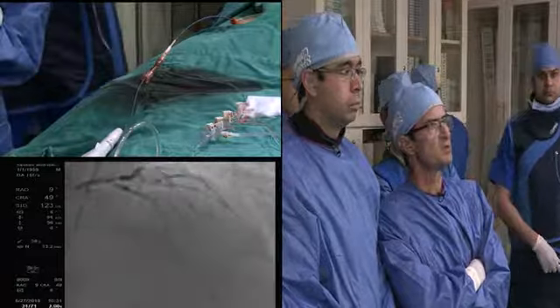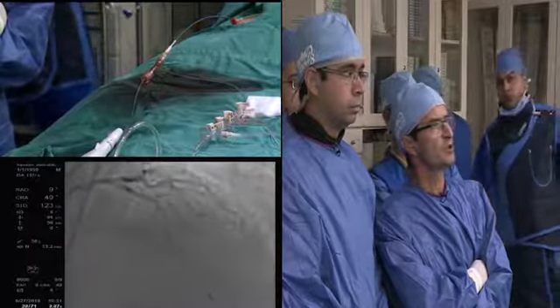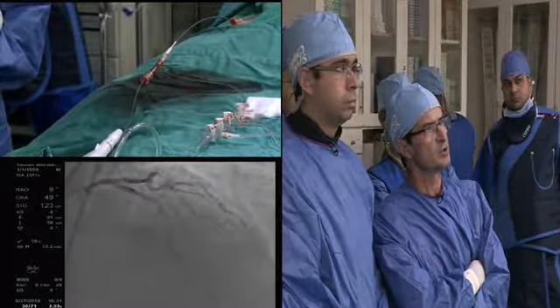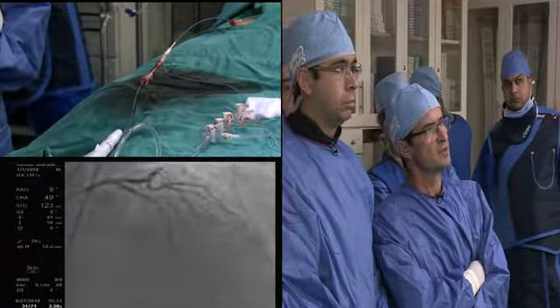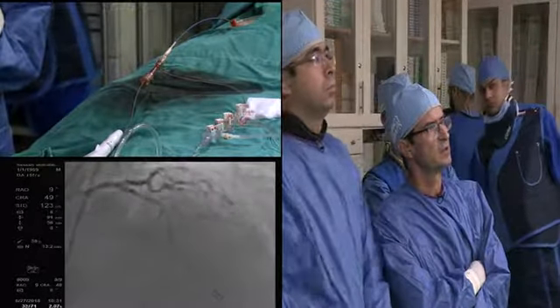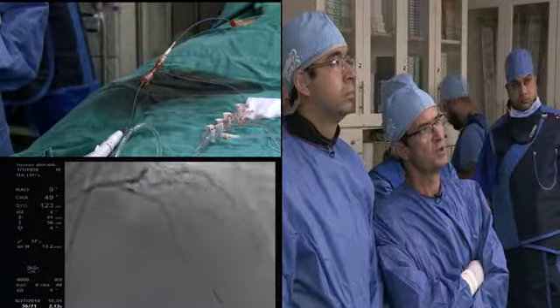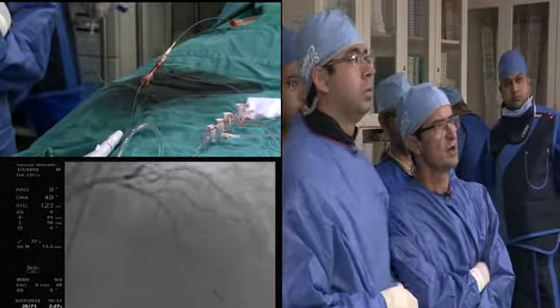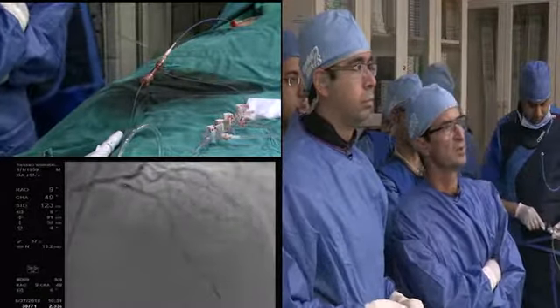Okay, the pressure is quite fine. We still have some branches, and we even have a better flow in the septal branch. And now I think there is a distal lesion, which is quite tough. But I also have a good sign, which is the increase of the size of the distal LAD, which is now much better than before.